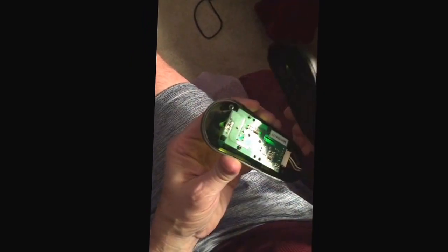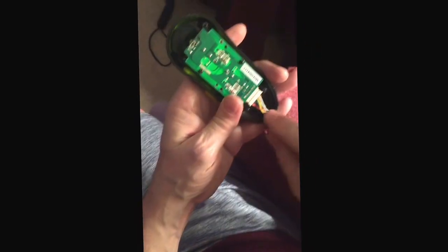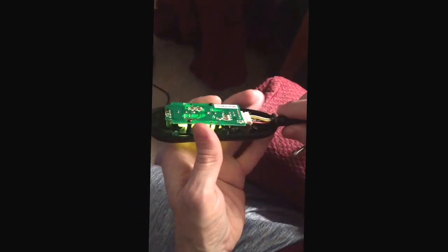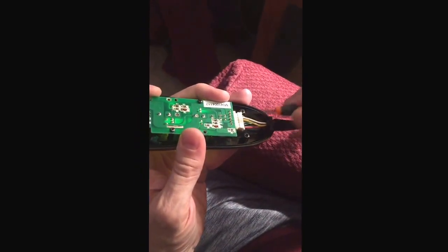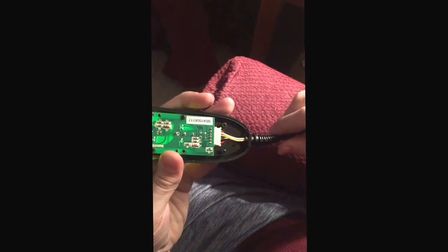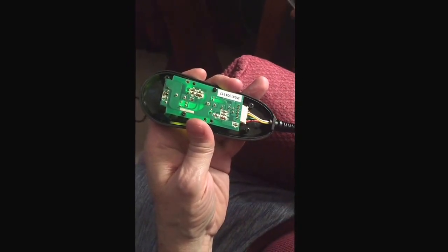And what has been happening is that this connector, what happens is these wires pull into here and pull this connection out. So this needs to be, I've done this before on this connector and it keeps coming out. You need to push this back in like that, that is how it's supposed to be. And I've done that a couple times. I've put it back together and it keeps coming apart.